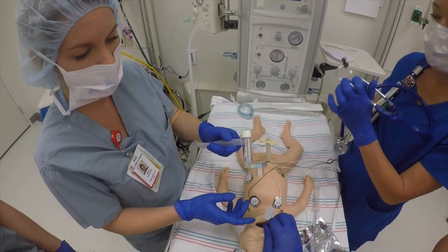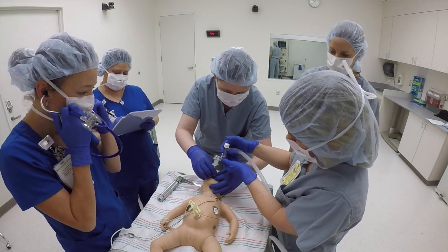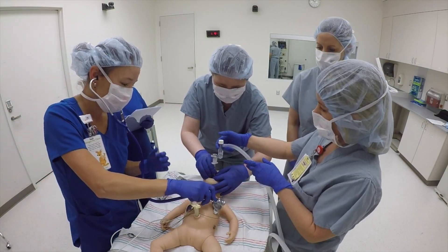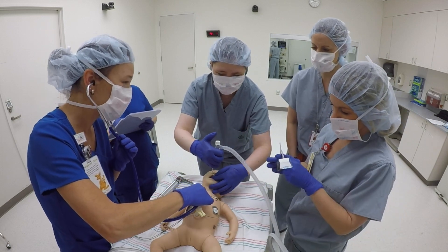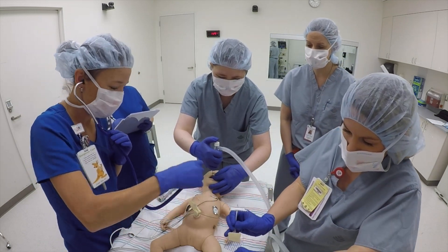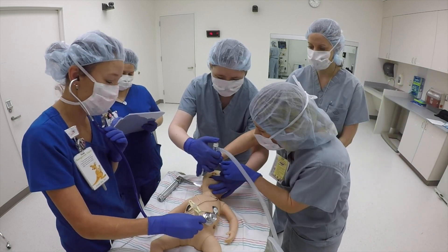Let's check with the CO2 detector. We've got good color change, mist in our tube, and good chest rise. Kelly, do you hear breath sounds? And if you could check for air in the stomach please? Breath sounds are equal. No air in the stomach.